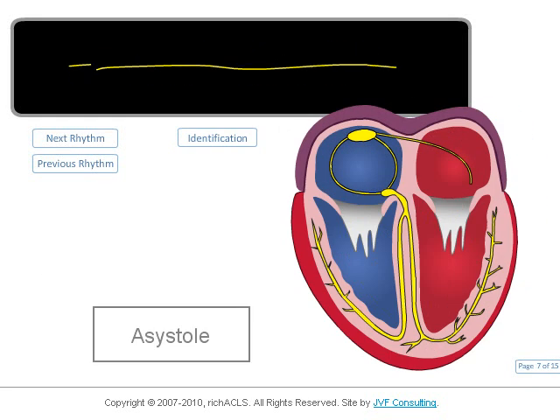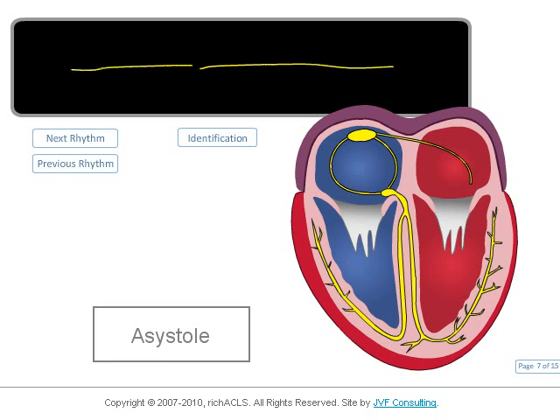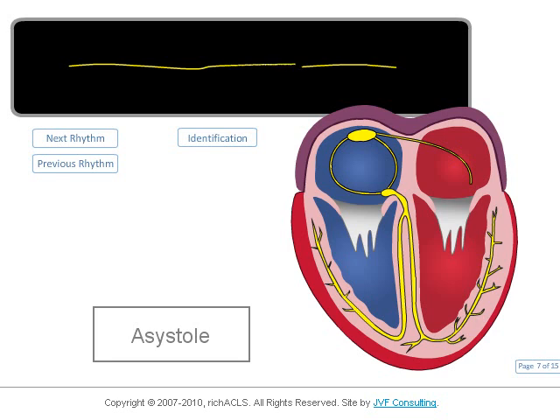Here is asystole. Asystole is usually the result of a heart that has gone from a coordinated perfusing rhythm to ventricular tachycardia, to coarse ventricular fibrillation, fine ventricular fibrillation, then, after the substrate for metabolism has been depleted, asystole.